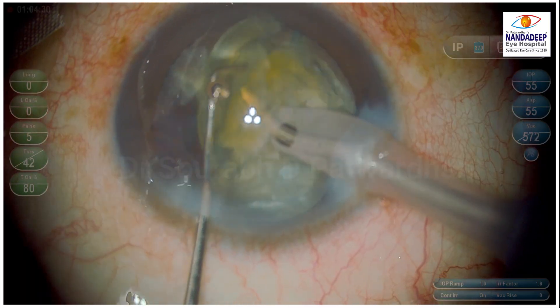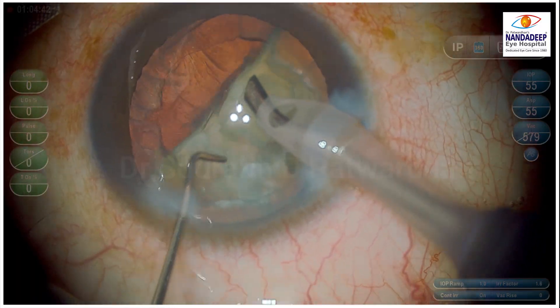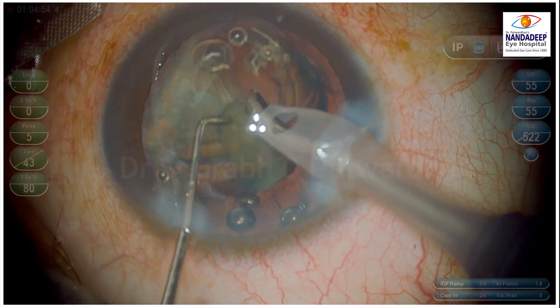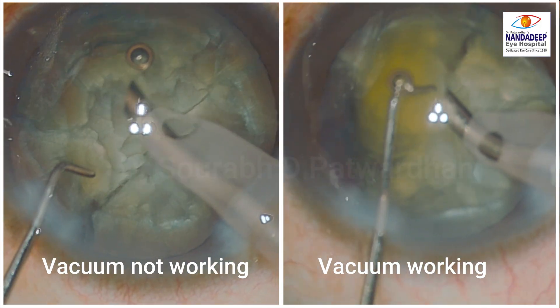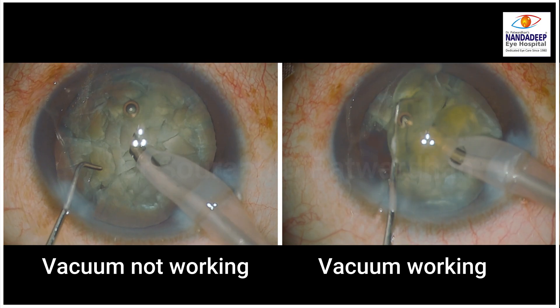Once I change the tip to a regular tip, you can immediately see the difference — the pieces are following and getting phaco-emulsified very easily, and within just a few seconds I could emulsify all the quadrants. On the left side you can watch that the vacuum is not working; on the right side you can see when vacuum is working, you can immediately pull out the pieces and hold the nucleus very easily.